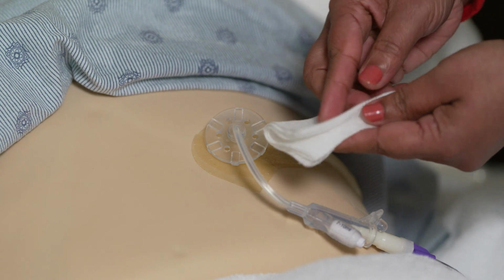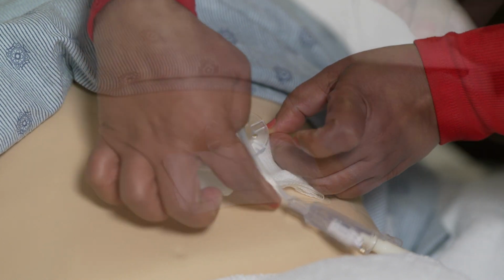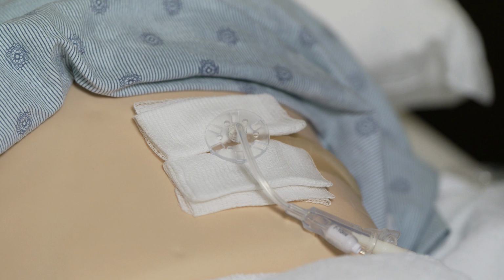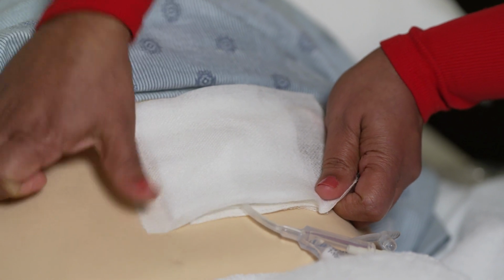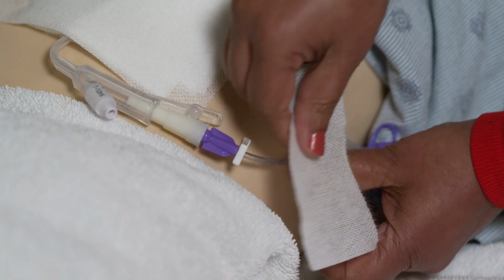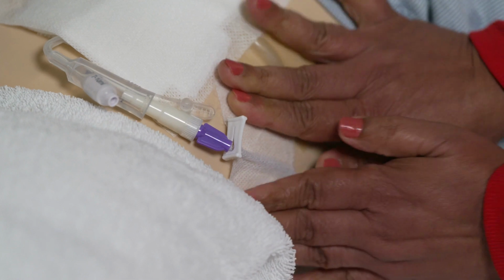To apply a new dressing, fold a gauze pad in half and put it under the bottom part of the tube disc. Place another folded gauze pad over the upper portion of the disc. Place a third gauze pad over the tube and tape it down. Always keep the extender of the J-tube taped to the skin. This helps reduce tugging on the sutures and dislodging the tube.